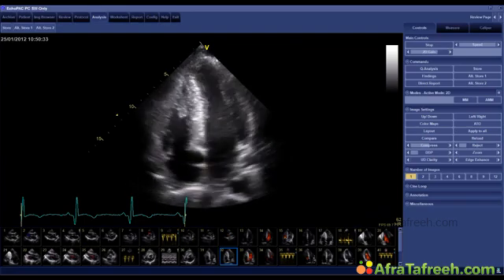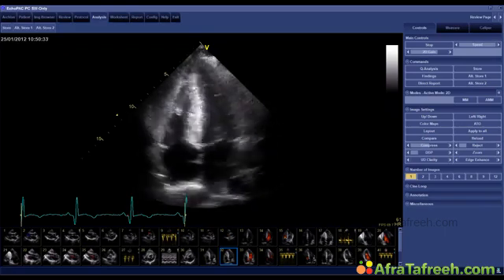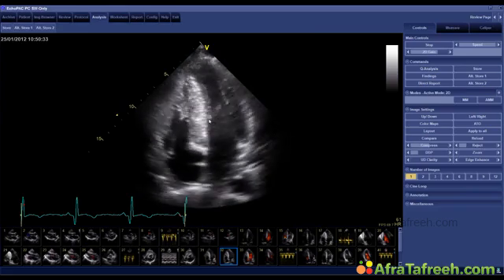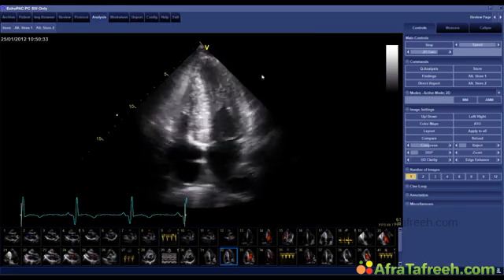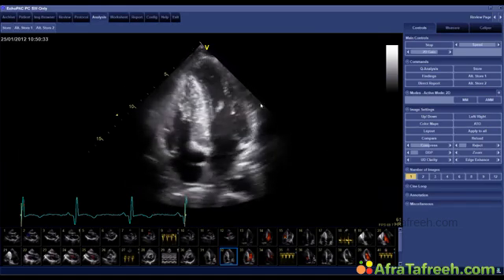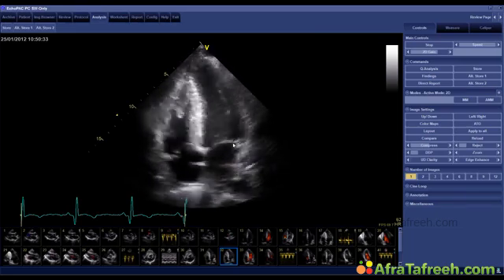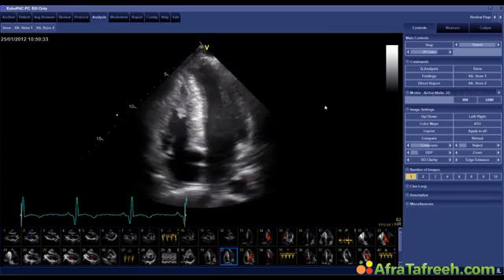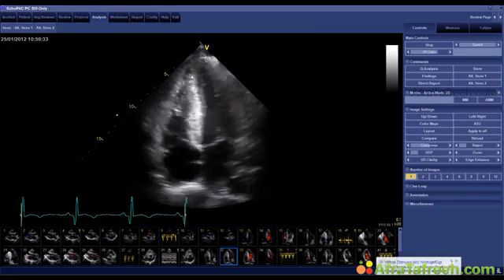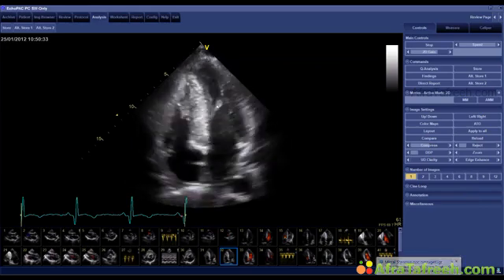The left ventricle has the shape of a banana. It's very slim. The cavity is small. And we have massive left ventricular hypertrophy and a very speckled appearance. So the answer to the diagnosis here is hypertrophic cardiomyopathy. This patient certainly has hypertrophic cardiomyopathy. This also explains why the patient just had this arrhythmia and almost died during badminton, because he had a malignant arrhythmia following cardiomyopathy.